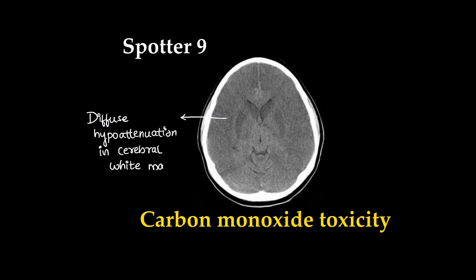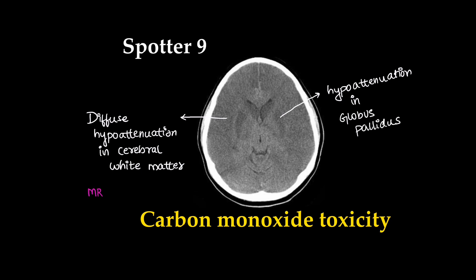This was a case of carbon monoxide poisoning. There is diffuse hypo-attenuation in the cerebral white matter. Hypo-attenuation in the globus pallidus is pathognomonic for carbon monoxide toxicity. MRI for further evaluation can be done.